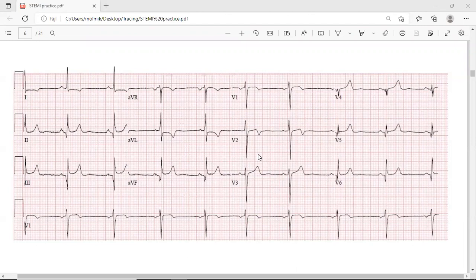You have good eyes. So if you diagnose only an acute inferior MI, that's okay, that's fine. And the lateral, I don't think so, because sometimes V6 is going a little bit behind, like lead number two, so it can be a sign of an inferior MI. Sometimes you can have ST changes in V6. So that's an inferior acute MI. That's it. It's enough if you say this. That's more than enough here. Okay, good. Thank you.